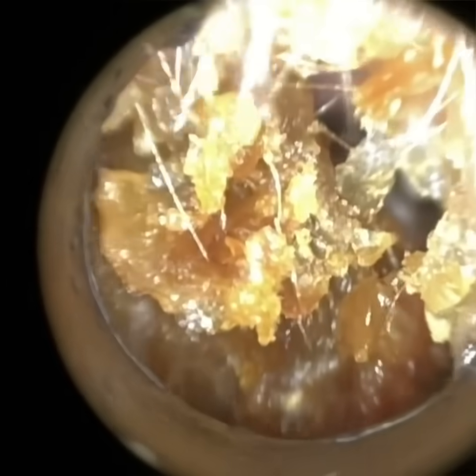But the surface is quite smooth and hardened, so it's difficult to get suction grip. So with this side, I'm able to use the forceps a lot earlier. On the other side, there was nothing to grip onto. I had to move the keratin plug inwards to be able to glide the jaw in between the keratin plug and the canal wall. But here, there is a bit of a section in the middle. I did use the forceps there, but it's still a bit tricky to get the grip.